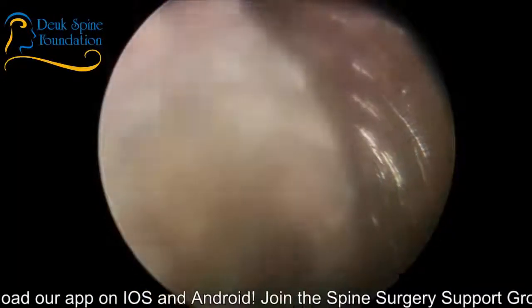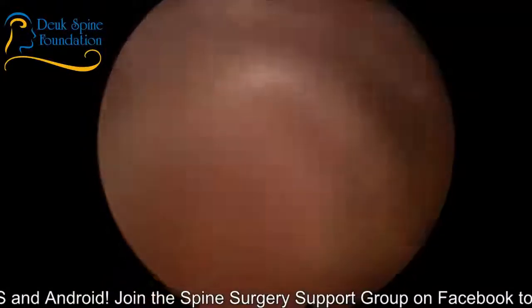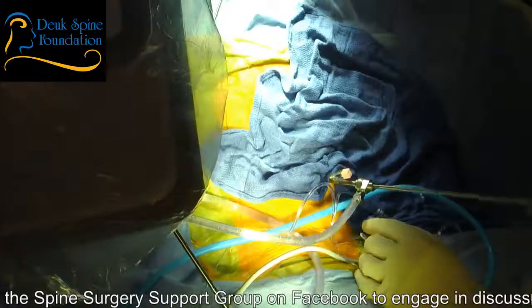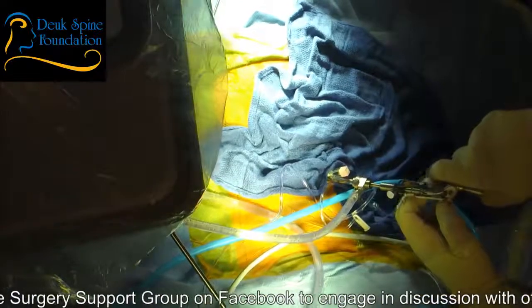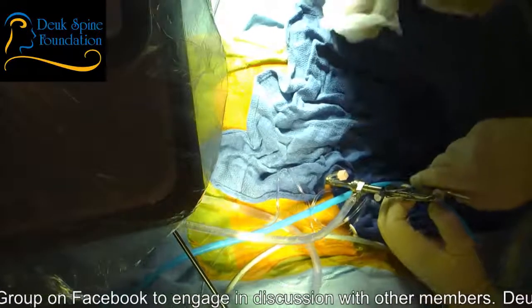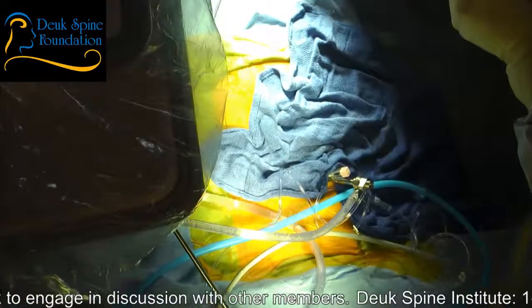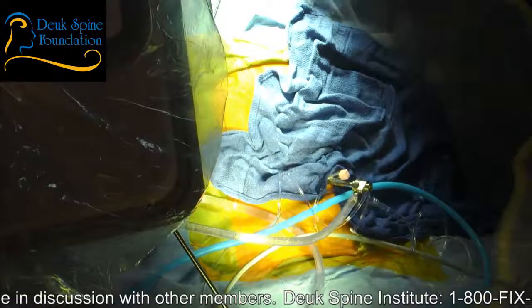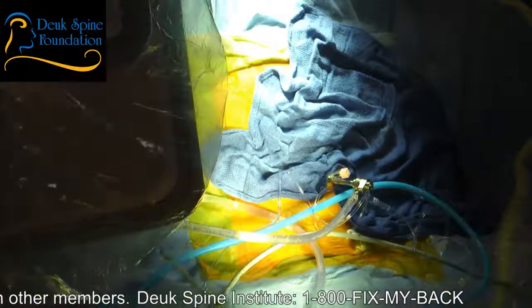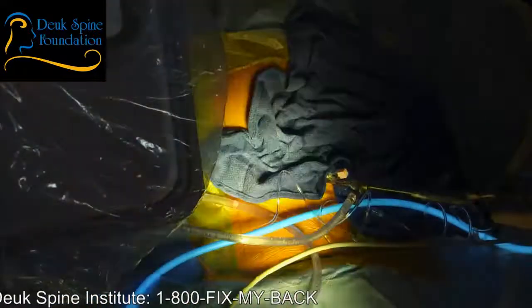All right, let's use our Grabzilla. Stand by. Scope off. Doctor, you doing all right? Let's see, take that, do not lose that. Let's get the scope back on and in. Right top, please, thank you. Watch this.